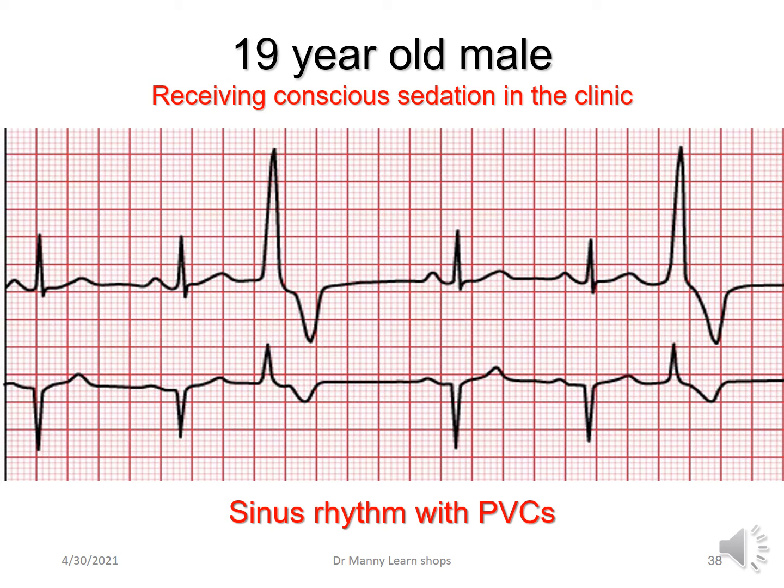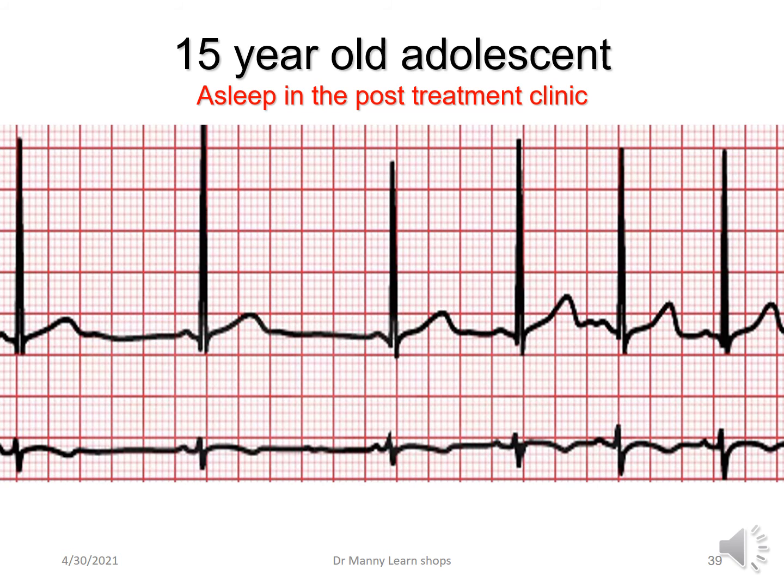He may need some oxygen. This is a 15-year-old adolescent asleep following treatment during the day, and he's just being recovered before he goes home. This is sinus arrhythmia.